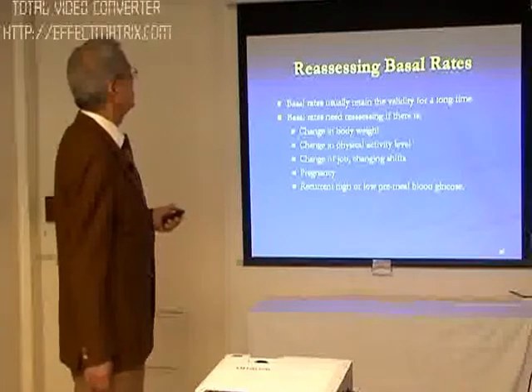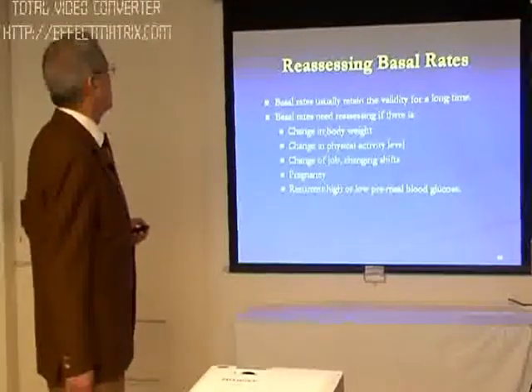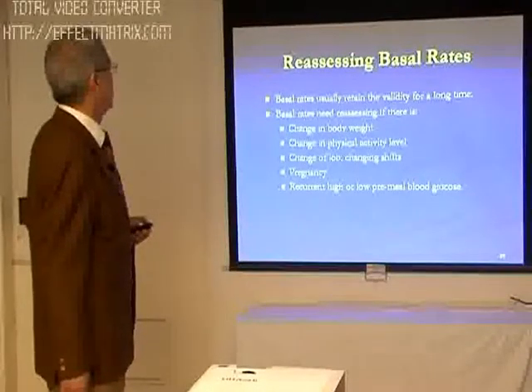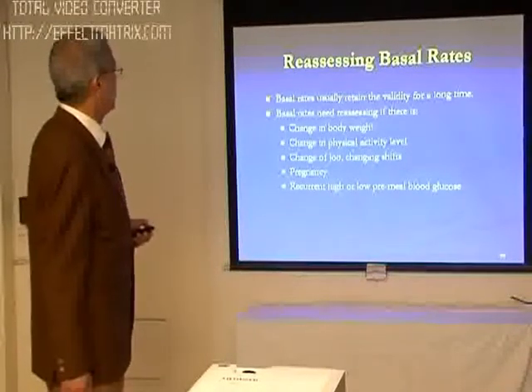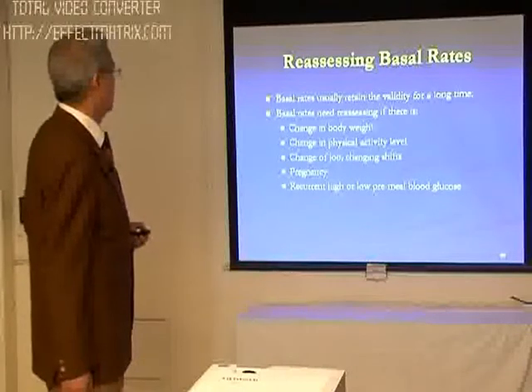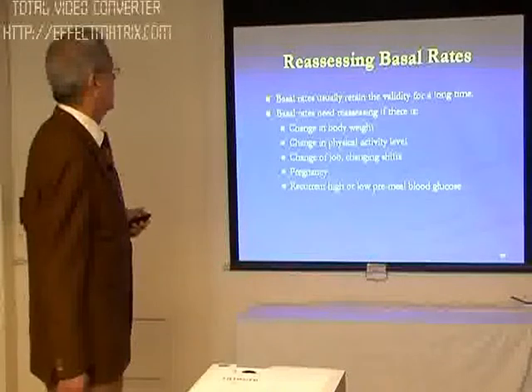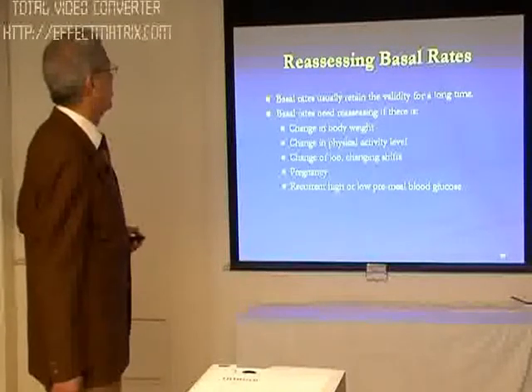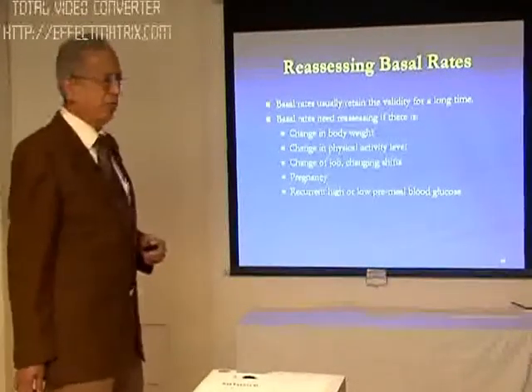The reassessing of basal rate is only required if there is a change in body weight. If somebody gains 10 kilo weight or loses 10 kilo, the basal will change. Even the boluses will also change, because the sensitivity will also change. And if the physical activity level changes, with a change of job or change of shifts. If the patient is pregnant, the basal as well as boluses will change. And if there is recurrent high or low pre-meal blood glucose, then again you will have to change the basal rates.